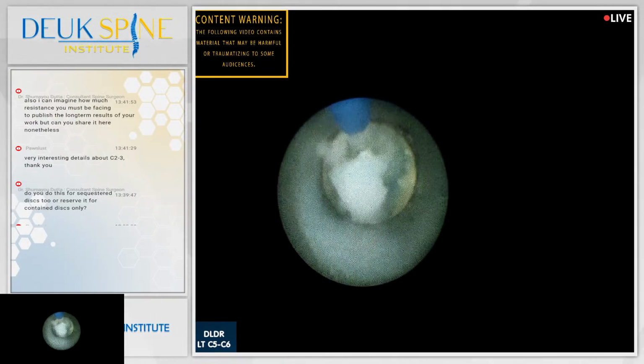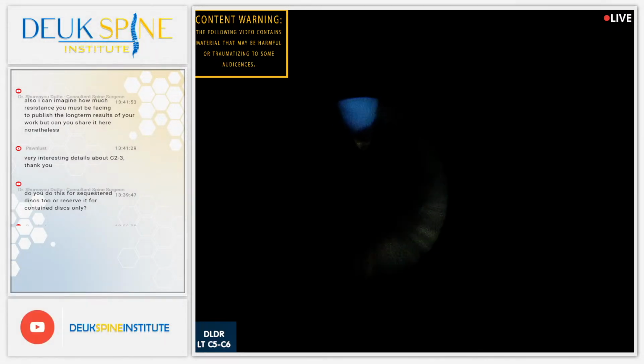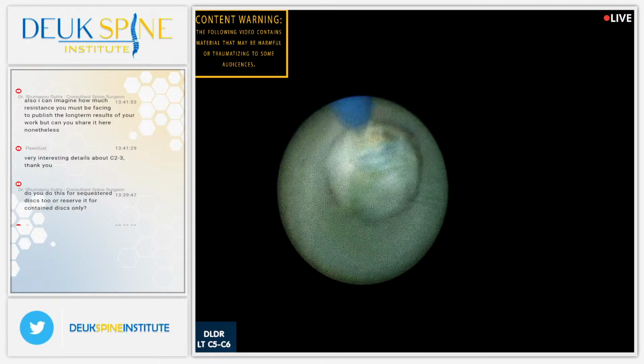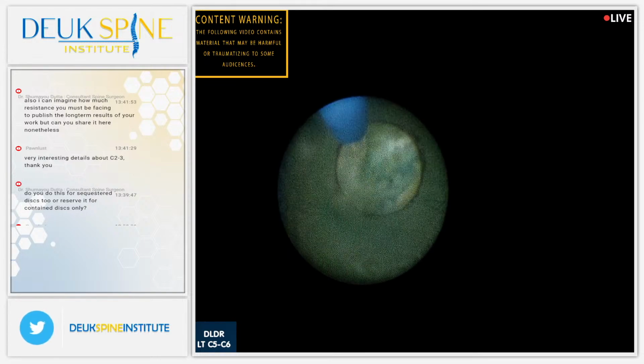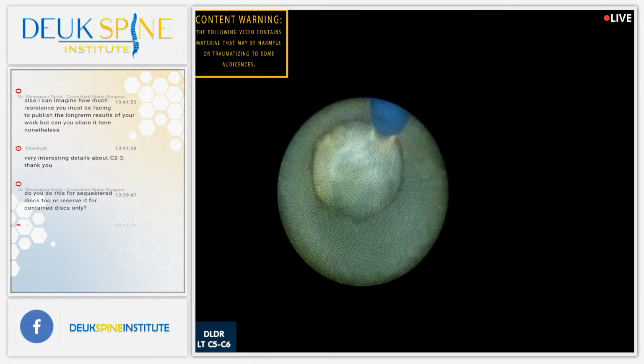That's right. Neither is the endoscope. The endoscope is oblique, right? It looks like an egg if you look at it, right? It's not round. So the endoscope egg has to fit into the tube egg shape. Does that make sense? So help me keep it pointing towards you.